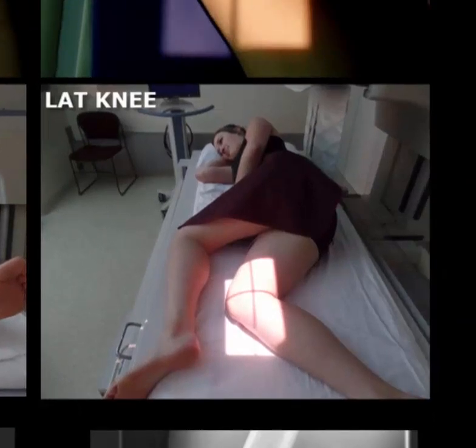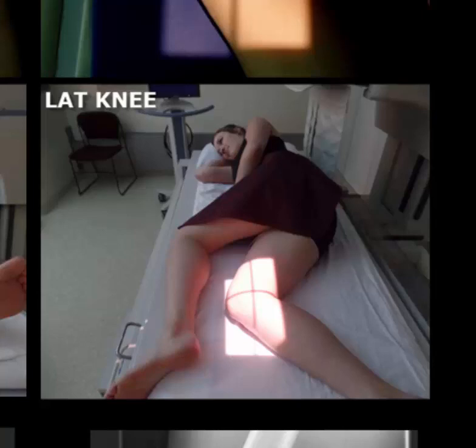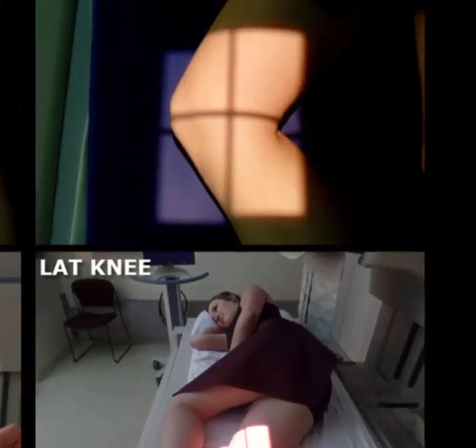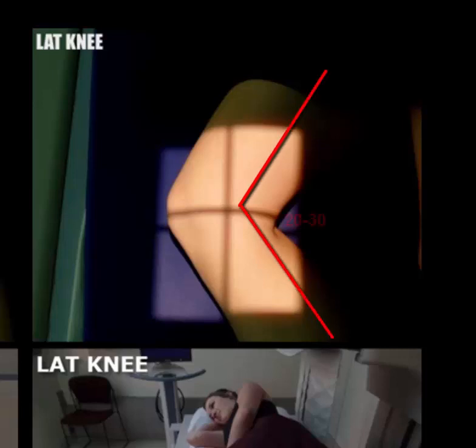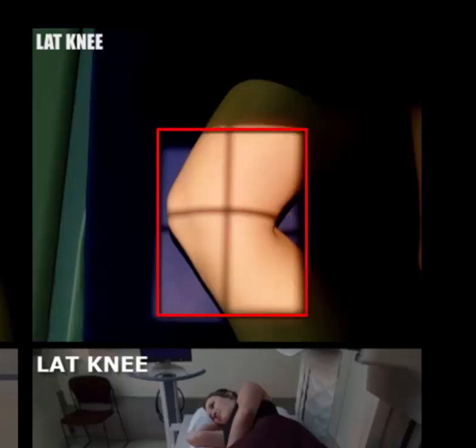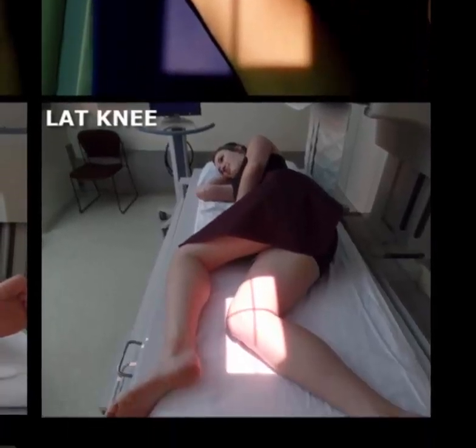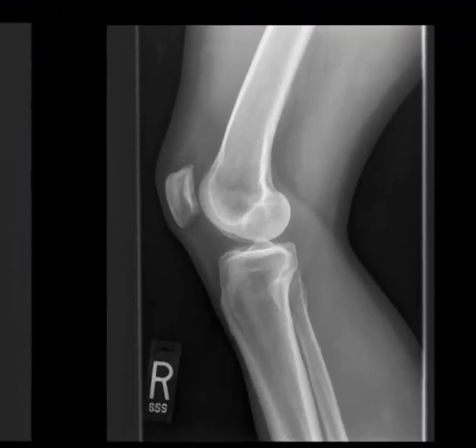Now, let's roll the patient onto their affected side for the lateral. Once the patient is lying on their hip, you will have to determine placement of the patient's unaffected leg — the goal is to get the femoral condyles perpendicular to the IR. Depending on patient mobility, place the unaffected leg either posterior or anterior as seen here. Keeping the 5-degree cephalic angle, direct the central ray 1 inch distal of the medial epicondyle, and ensure that the leg is flexed approximately 20 to 30 degrees. You have now performed a routine 3-view knee series.